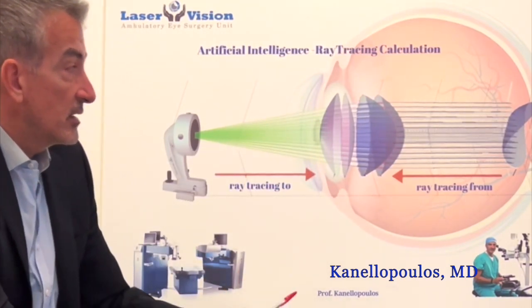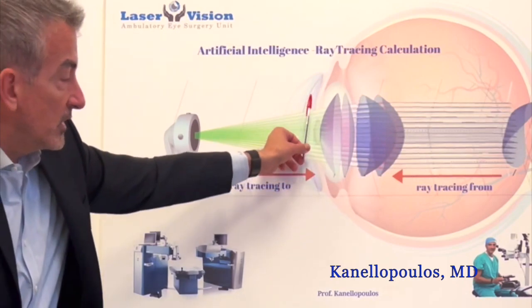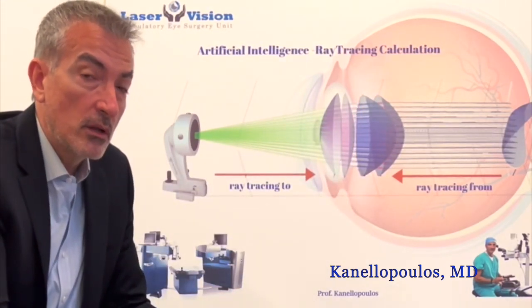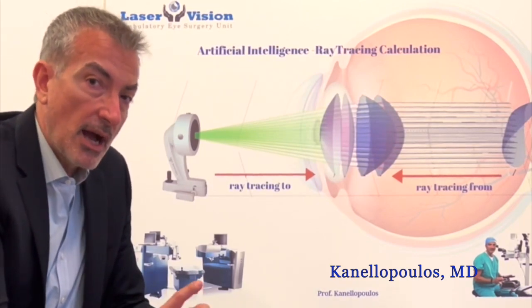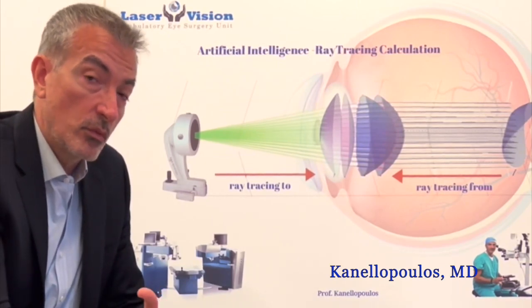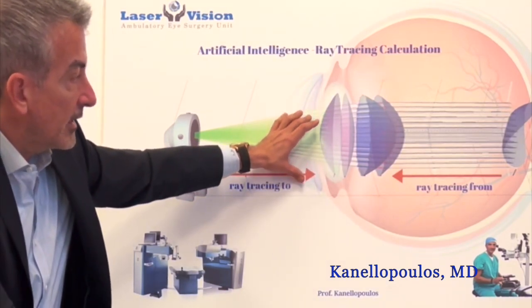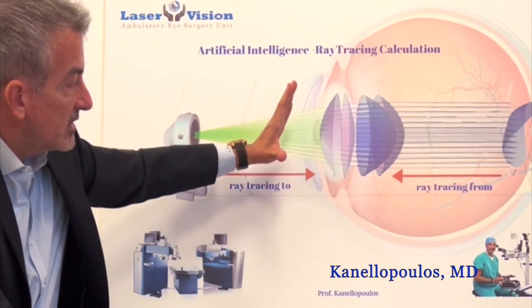Even regular astigmatism can act as a prism. I omitted to mention that one of the key elements with ray tracing is that it also calculates the tilt between the cornea refractive surface and the lens as a refractive surface, and this opens a great window in treating keratoconus, and we published on this in the Journal of Cornea as well. In contrast to all the work that we've done in treating cornea irregularity and keratoconus with a topography-guided normalization, which views the cornea only, the Innoveyes software views an ectatic cornea, which usually is ectatic in its inferior part, as a cornea that is tilted.